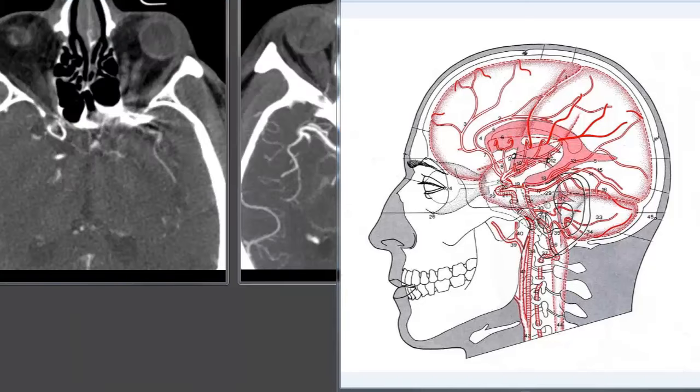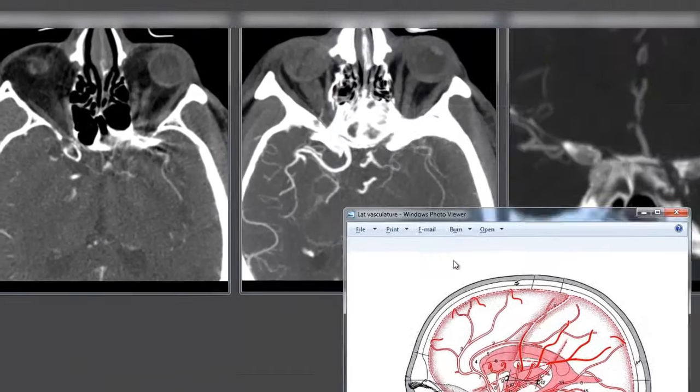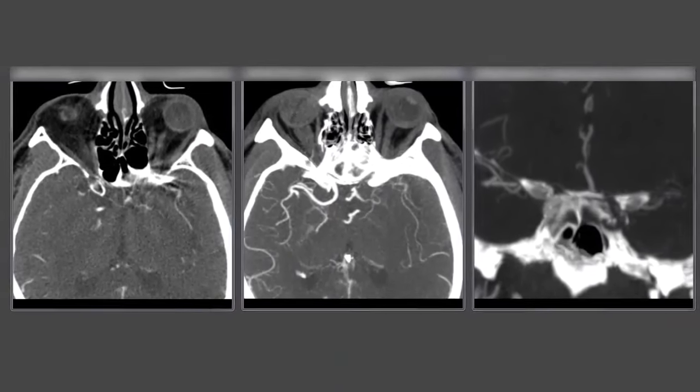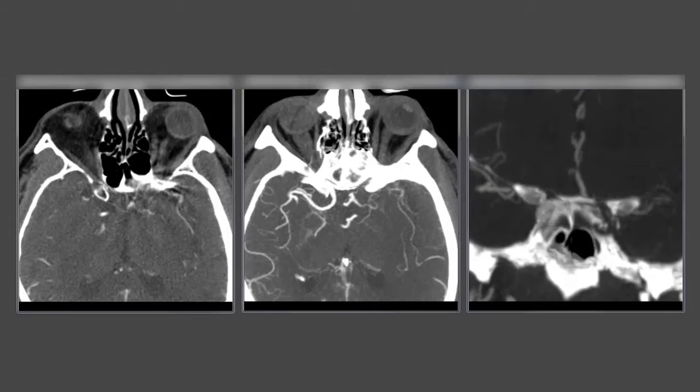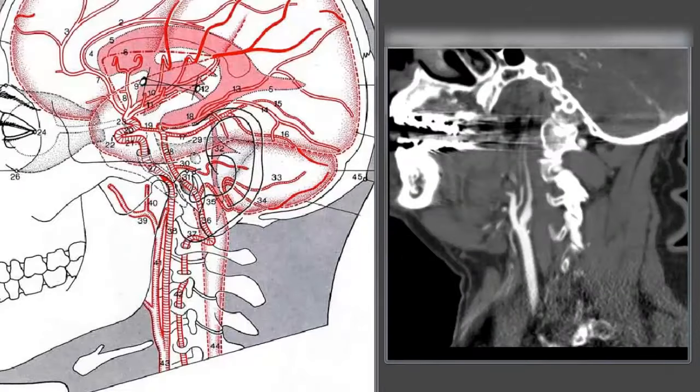We'll bring up our CT angiogram portion down in the neck reconstructions and get a view of what's going on in our patient's situation. Now we're looking down in the neck portion of the same patient's CT angiogram and this is a thick MIP reconstruction through the left internal carotid artery's origin in the neck.